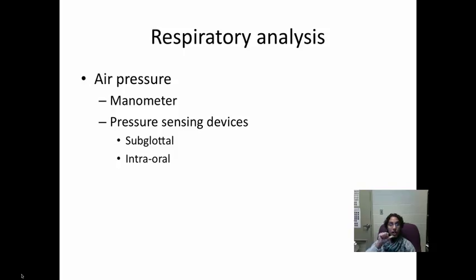Then she wanted to measure a breathy voice, a pressed voice, and a resonant voice, so we had 3 different qualities: pressed, breathy, and regular voice. Then we had 3 different loudness levels: soft, loud, and normal loudness, and at 2 different pitches.